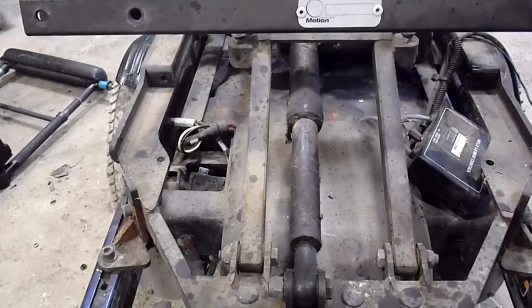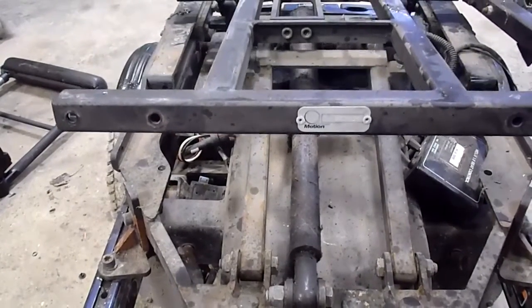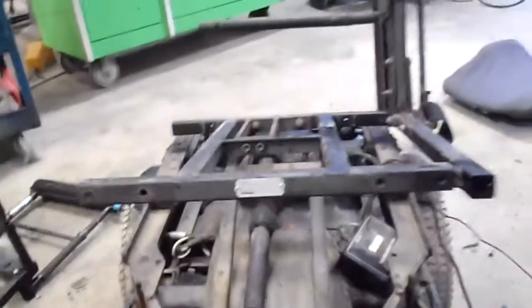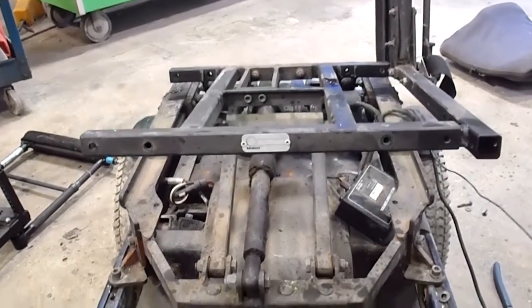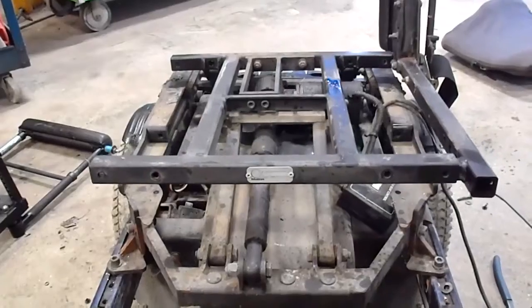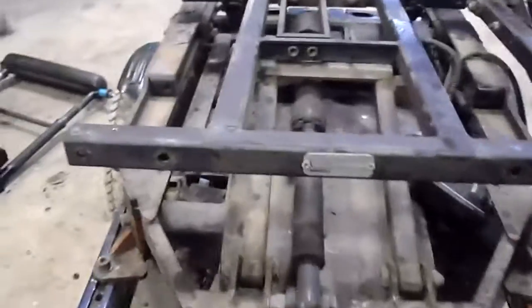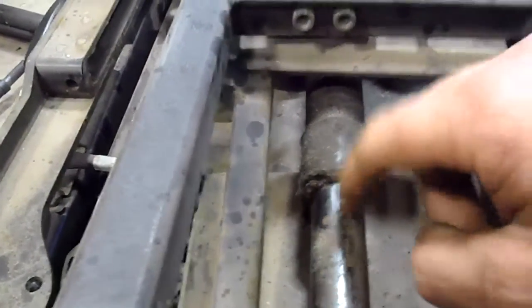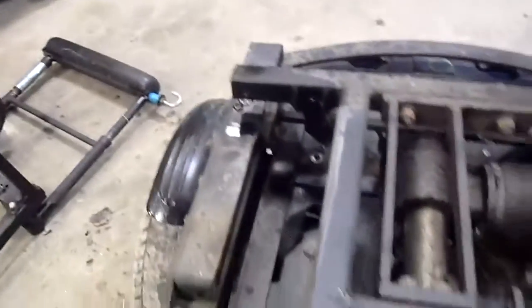And I don't think that's the end of its travel, so I better find out what's going on there, because if it doesn't want to go down flat, then I'm going to have to adjust that in the seat, because I don't want it tilted back permanently like that. Not too sure what's going on there. But anyways, I'll get this frame sitting flat. Maybe that is flat. I don't think so, because it looks like there's still an inch or so of travel there. I might have to adjust it a little bit.